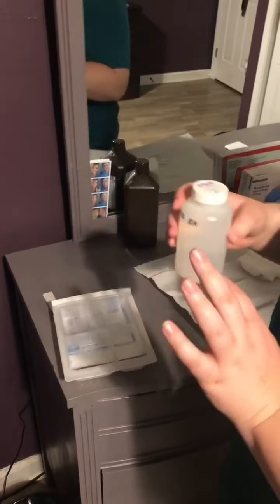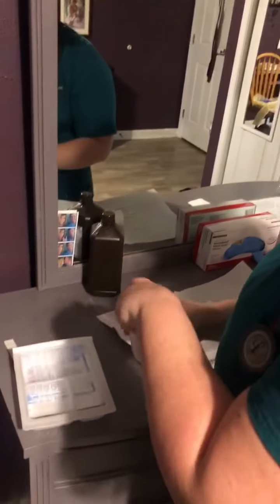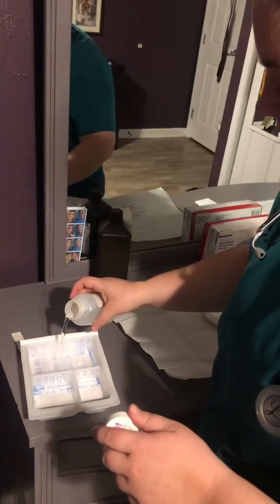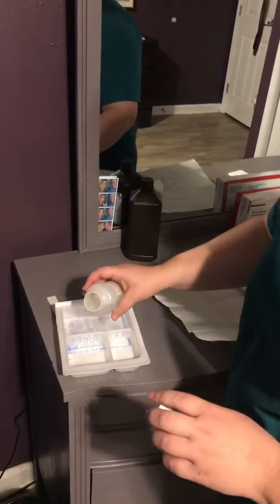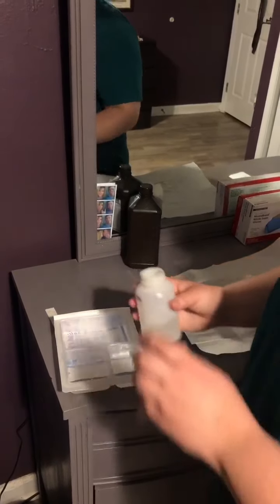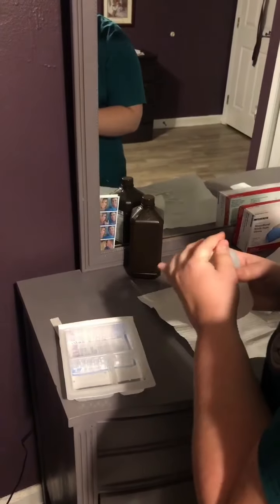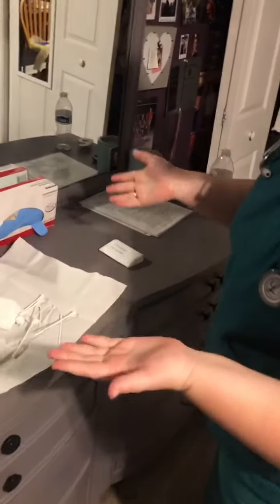So when I have my normal saline and my hydrogen peroxide, first I'm going to check the expiration date, and then after I open my normal saline, I'm going to write my initials, the date, and the time, because it's good for 24 hours. So then these 2 containers I'm just going to fill with normal saline. And then I'm going to get clean gloves on. My hands are washed.